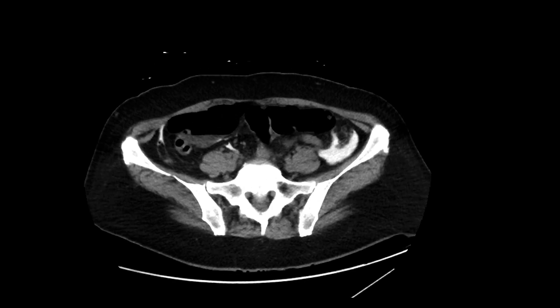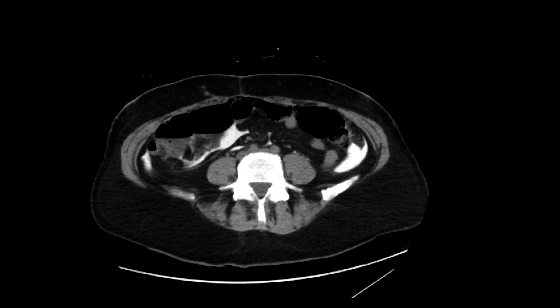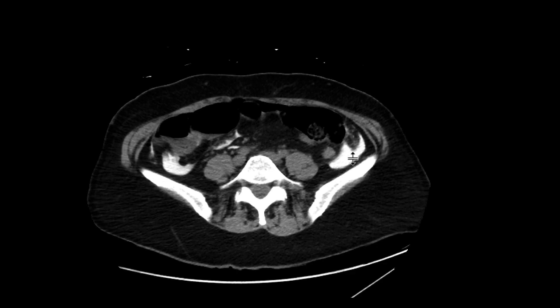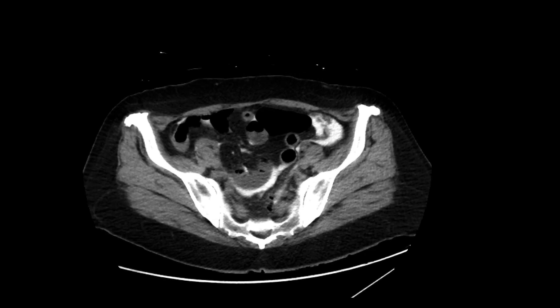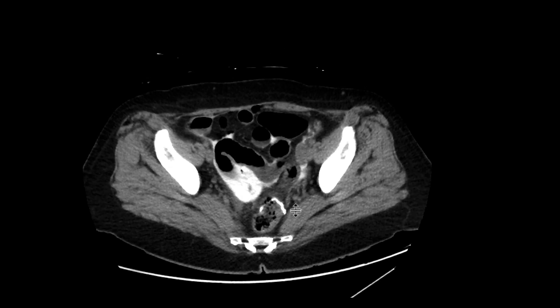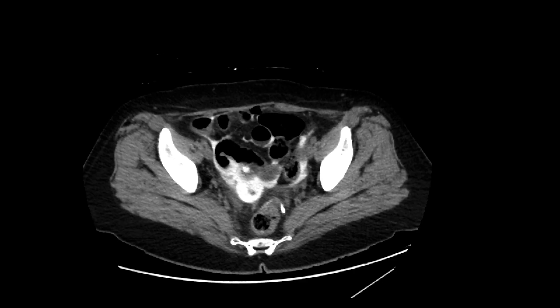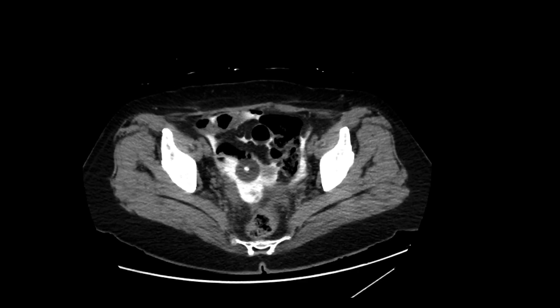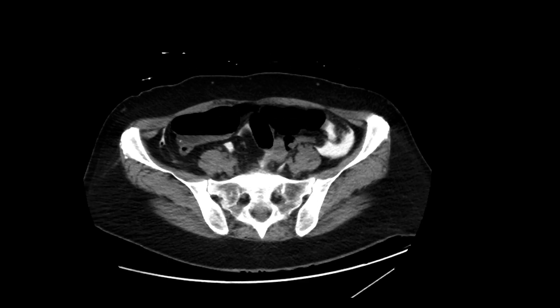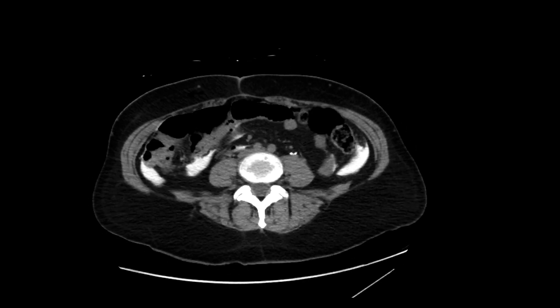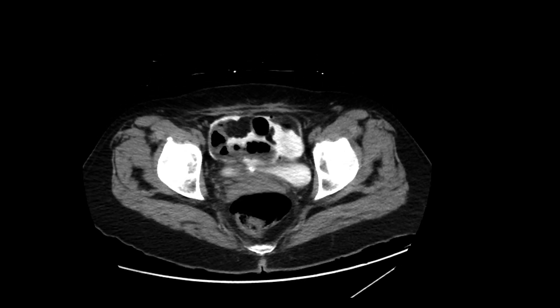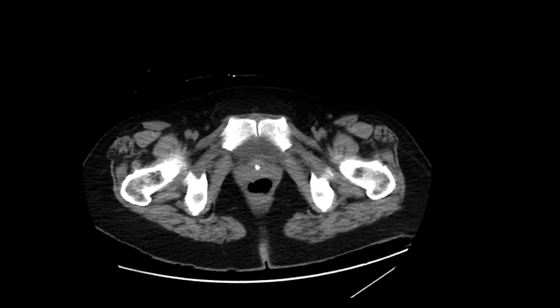The location is really within the intraperitoneal spaces. We can see that it's going upwards here in the pericolic gutters, and we can see some of that contrast within the mesentery itself and all the way down here. So there's a lot of contrast within the intraperitoneal spaces, and no real contrast in the extraperitoneal space.